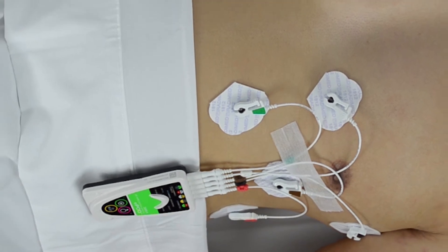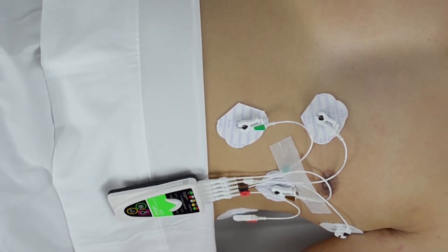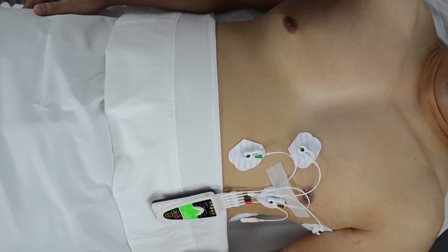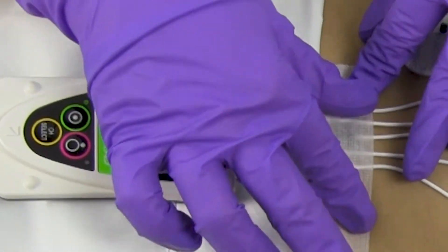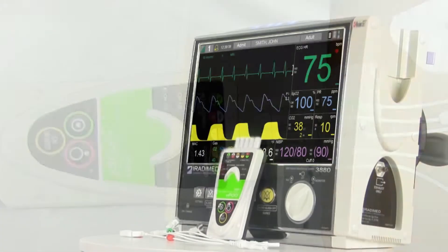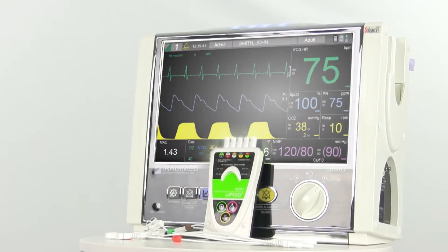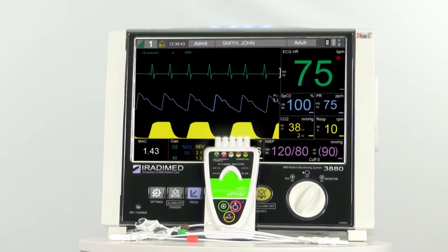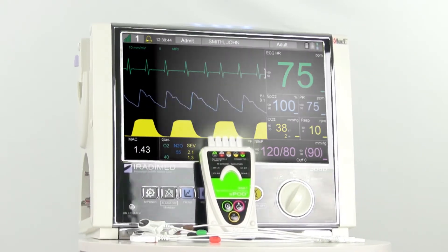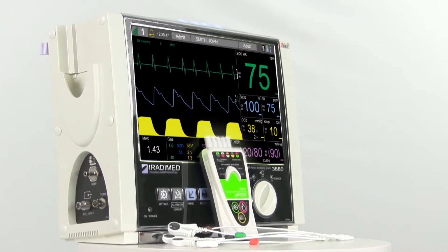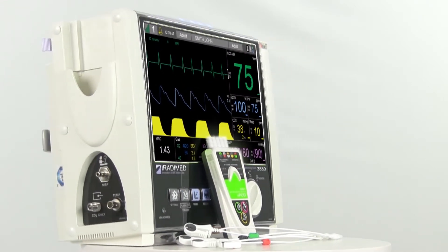Next, minimize the distance between each lead wire by bunching them together, avoiding any large gaps between wires as shown. Tape the lead wires to the patient to minimize vibrations. If a certain sequence consistently provides gradient noise on the waveform, the 3880 provides a tool to record the gradients onto a USB drive to submit to iRaDaMed.